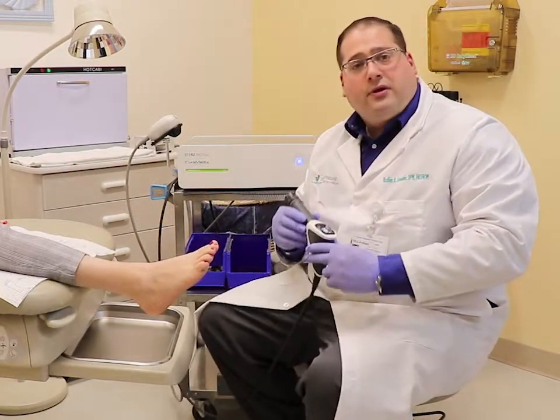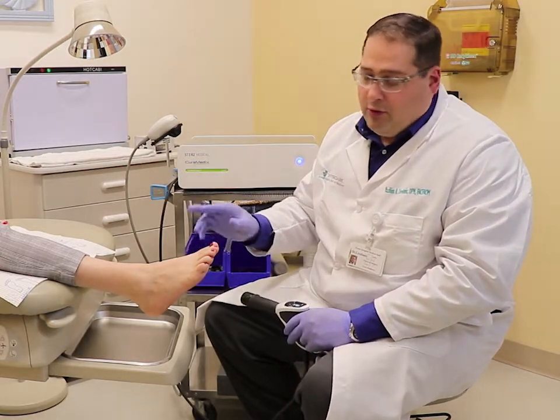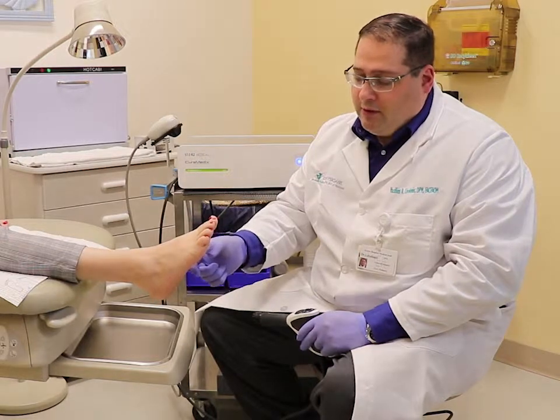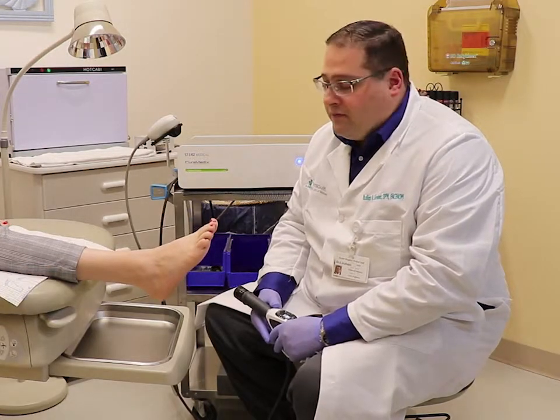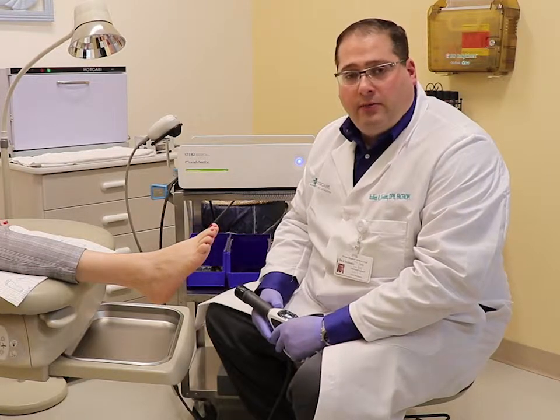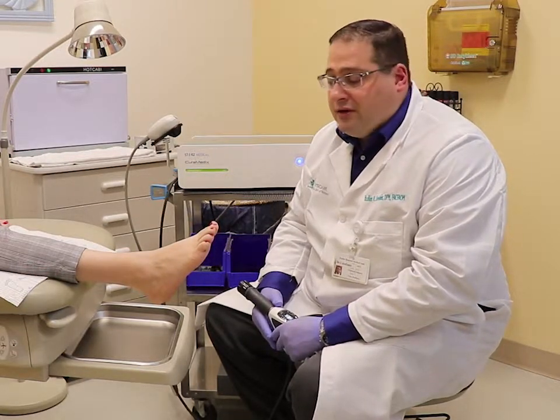As mentioned, these are preset to 3000 pulses. Treatments include both the smaller one to the heel and the larger one to the entire foot — it's part of the treatment that we do. These are set up as weekly intervals for four weeks. At the end of the four weeks, we do a two-week follow-up to reassess and see the pain level that the person is in.